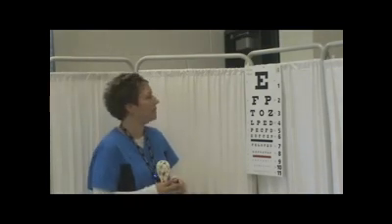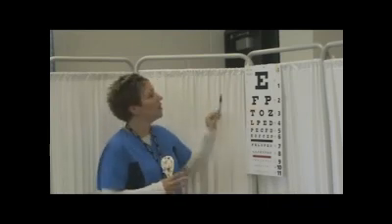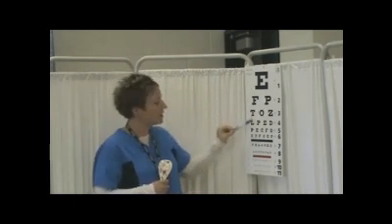You have the client cover one eye at a time and assess each eye individually. It's important that you have something to point with rather than your finger, because it's very easy to occlude the letters. You just start at the top and have the client identify each letter. Continue working your way down until the client is no longer able to read a full line.